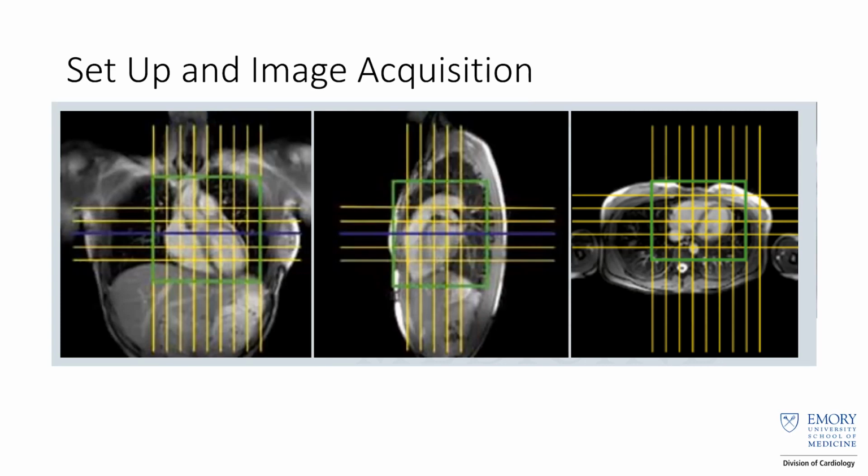When patients come down, as far as setting up their images, we use three orthogonal planes to center the heart and figure out exactly where the heart is when the patient gets down on the table. Then we set up these axial, coronal and sagittal sections through the heart and proceed from there. Once everything is centered and we can view things in multiple planes, we have the patient go through a series of image acquisitions, which include breath holds to minimize respiratory motion, and get isolated pictures of the heart and answer the question we're trying to answer.